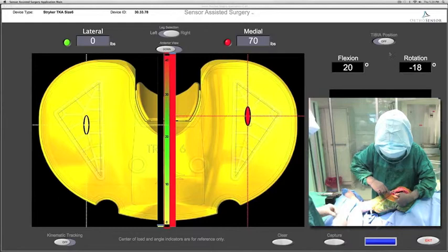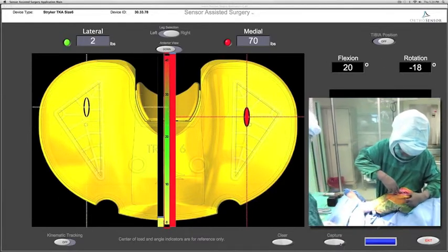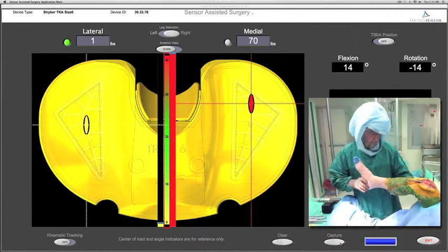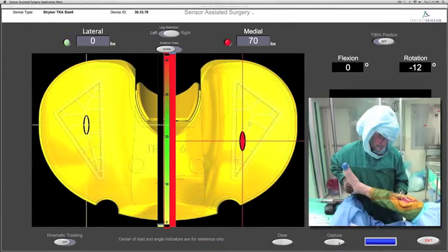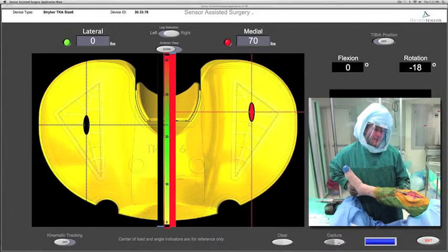After the trial components have been seated, the surgeon is seen to place the orthosensor knee balancer 9 mm, similar to the standard trial, into the knee joint. He closes the medial capsule to minimize any artificial tensioning due to an open medial capsulotomy, and now takes the knee through a range of motion.